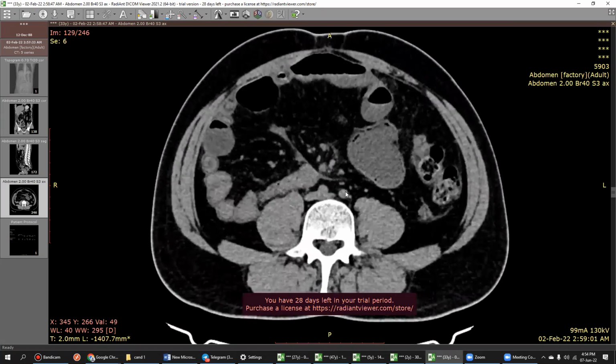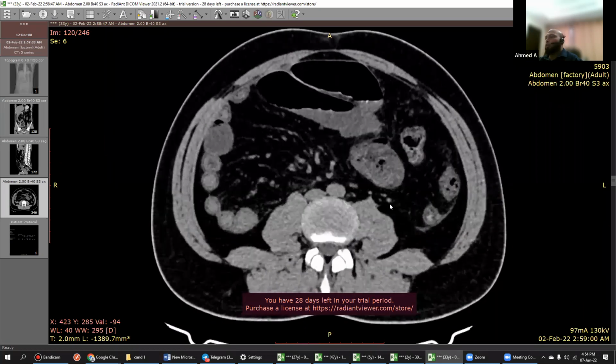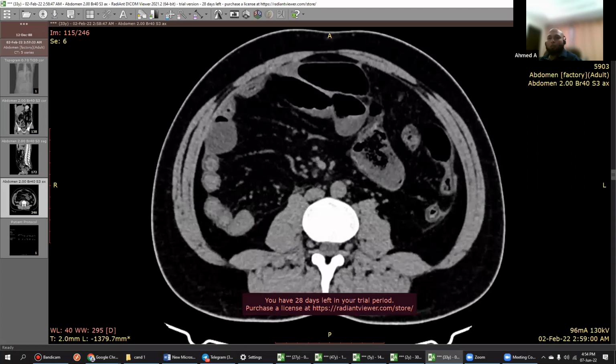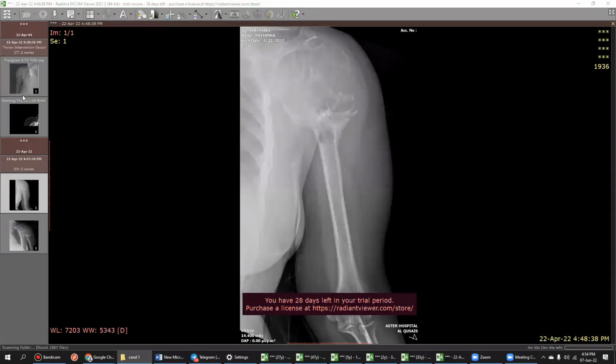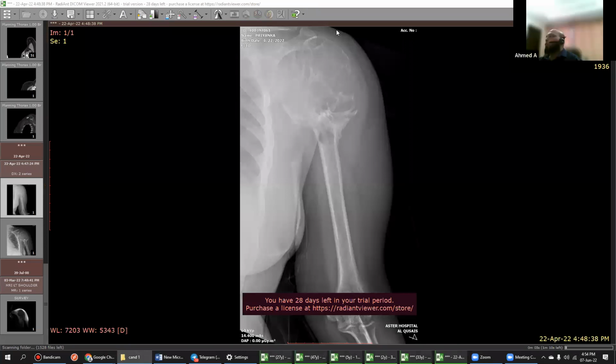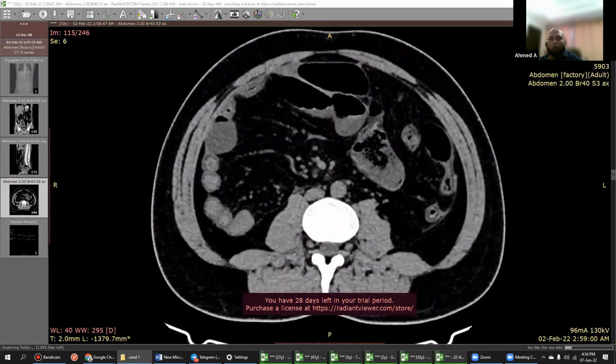So what was the calcification thing? If anything we could say, what was the calcification? You can just leave the mouse, please. What was the calcification thing? Any idea? Calcification, I'm not sure. I'm not sure. Okay, no problem.